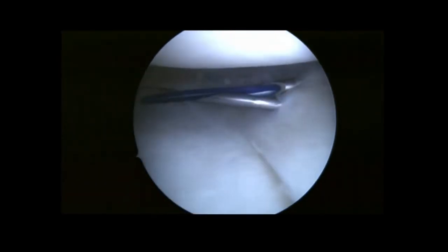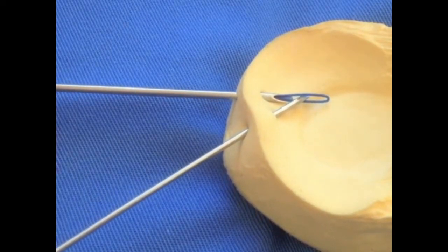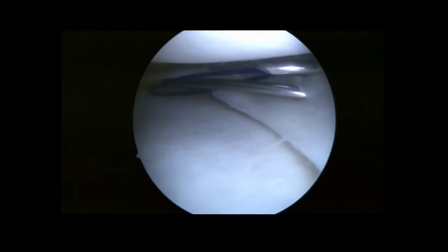Once both needles are placed satisfactorily, unloading of the lasso loop needle into the joint is performed. Then, the needles are oriented toward each other in order to introduce the single suture into the lasso loop. Care must be taken to avoid chondral injury with the needle tips.